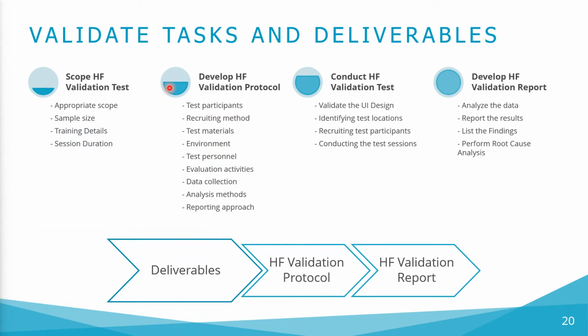Develop HF validation protocol. This protocol defines how we will validate that the product can be used safely and effectively by intended users. The protocol will describe the test participants, recruiting method, test materials, environment, test personnel, evaluation activities, data collection and analysis methods, and reporting approach. The protocol will also include a list of use scenarios and knowledge tasks, each of which will be linked to one or more critical tasks identified in the use related risk analysis.